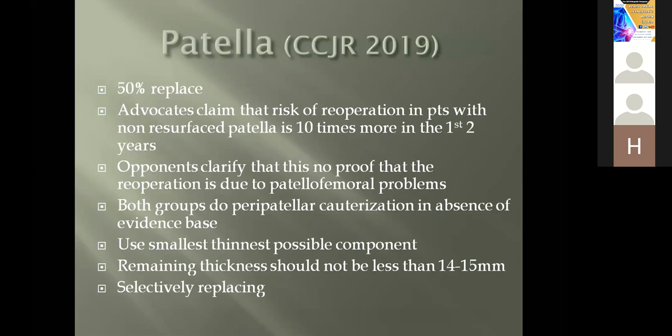If we are talking about the patellar replacement concept, in the Current Concepts in Joint Replacement meeting last December in 2019 in Orlando, USA, the consensus reached these conclusions. 50% of them replace the patella and 50% are not replacing. Advocates of patellar resurfacing claim that the risk of reoperation in patients with a non-resurfaced patella is 10 times more in the first 2 years because of anterior knee pain.